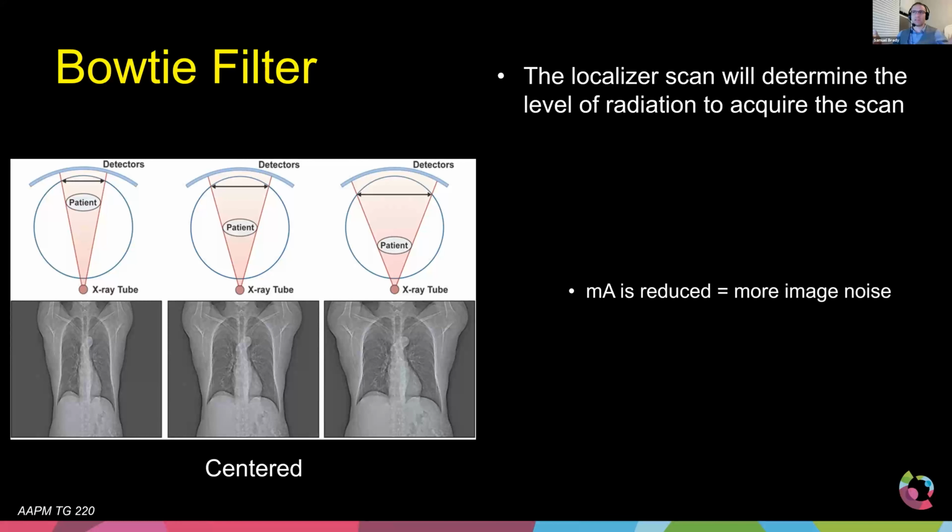It's actually a great technique. So, do you still need to do your topograms or your scouts? Yes. And does it matter which order? If the vendor says to do it in a specific order, yeah, you should do it that way. But for the most part, on more modern CT scanners it doesn't matter that much anymore because they use them both.